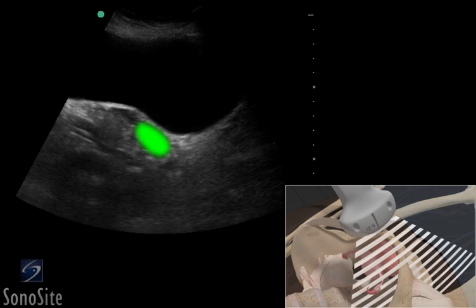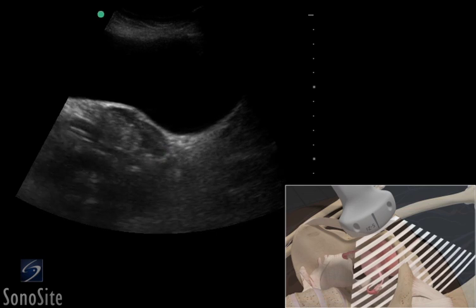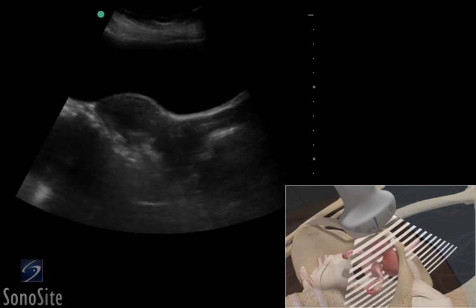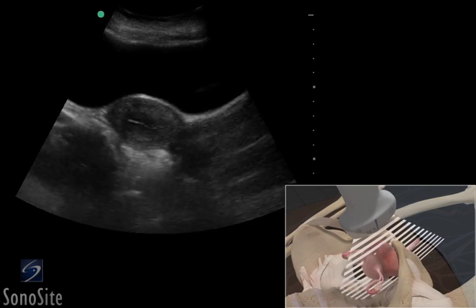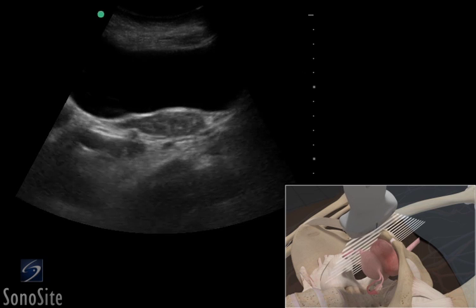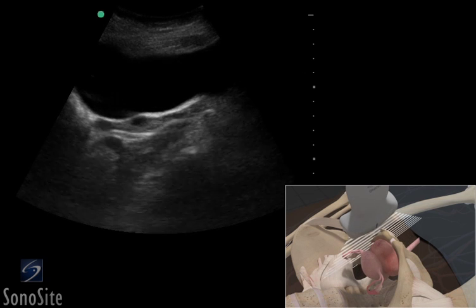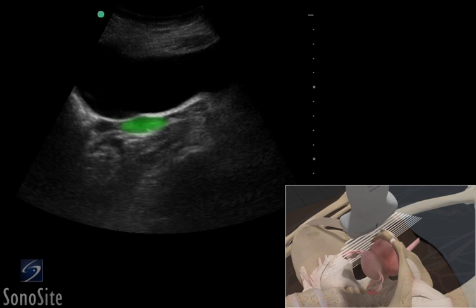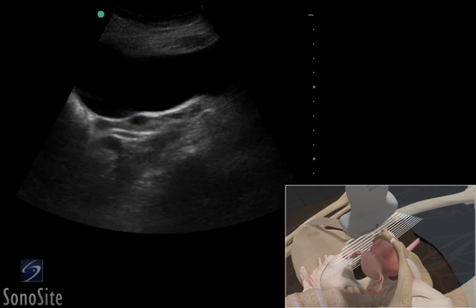The ovaries may be seen by sweeping the transducer to the lateral aspects of the pelvis. They are almond-shaped and slightly hypoechoic structures. Follicles may appear as multiple hypoechoic cystic structures within the ovaries. Some follicles may be quite prominent, depending upon the luteal stage.